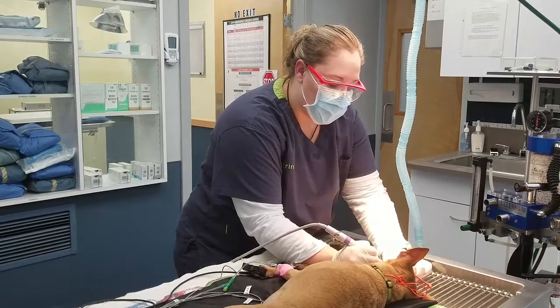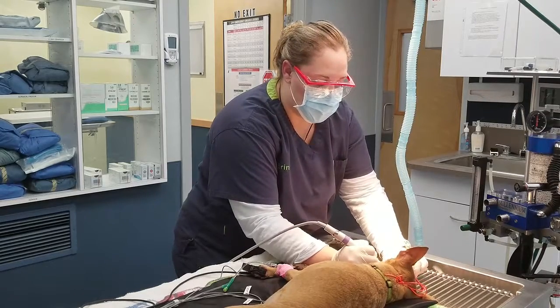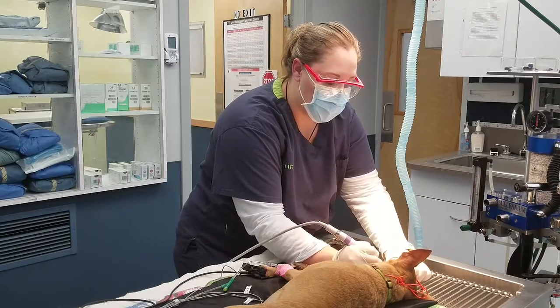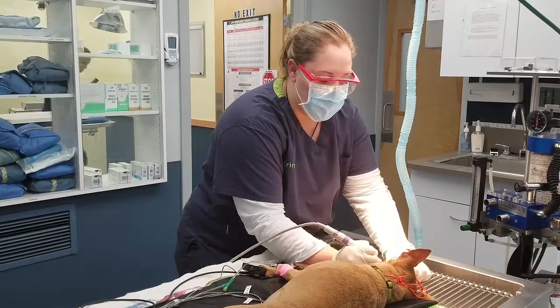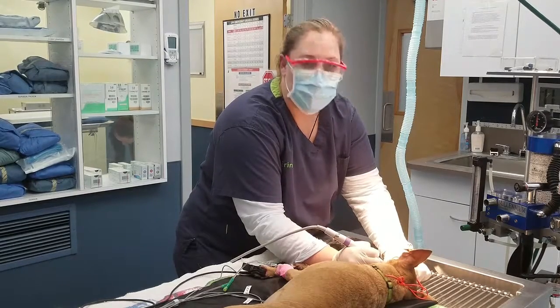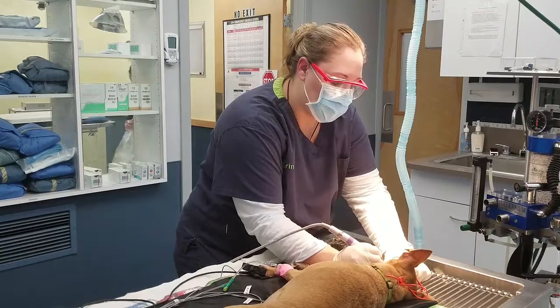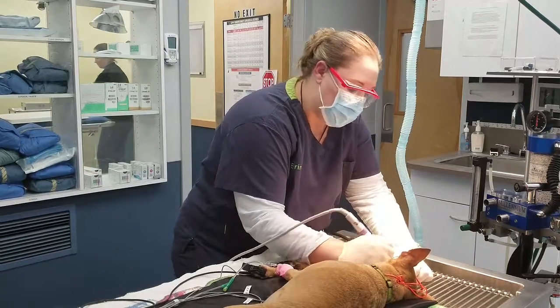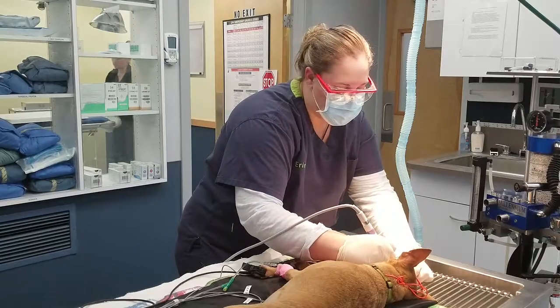Okay, the other thing you can do, if you have hardened large pieces of calculus and tartar, is use a tartar grabber to get those pieces off, to expedite the scaling process and eliminate some of the time spent on each tooth. The other thing you can do is some hand scaling, which I'm going to show you in a minute.